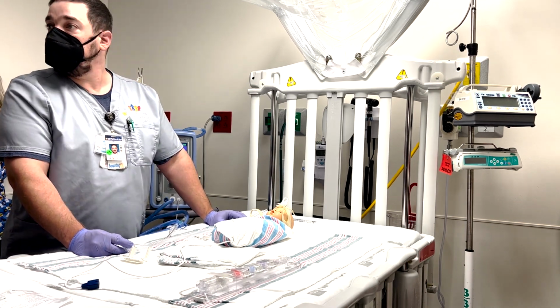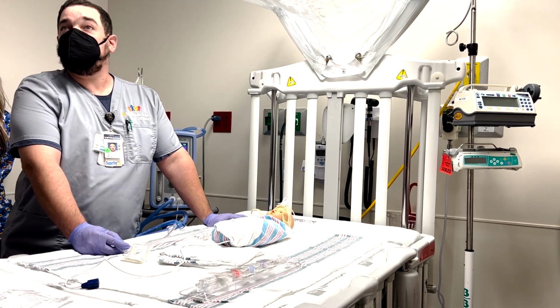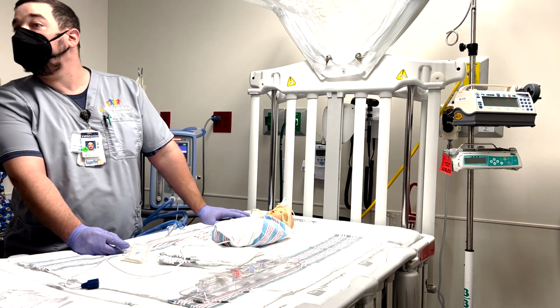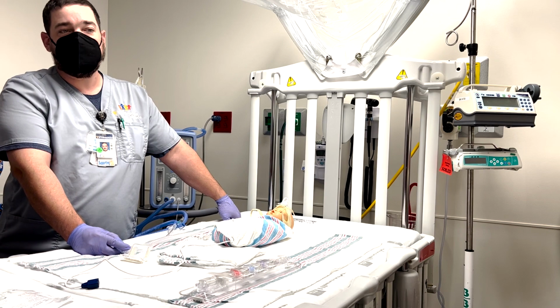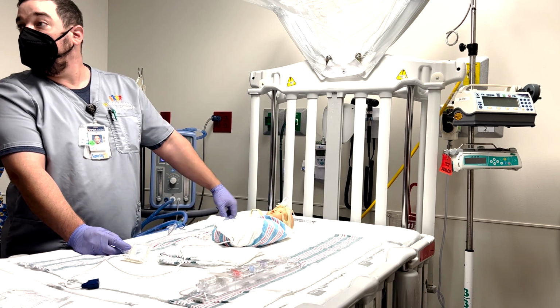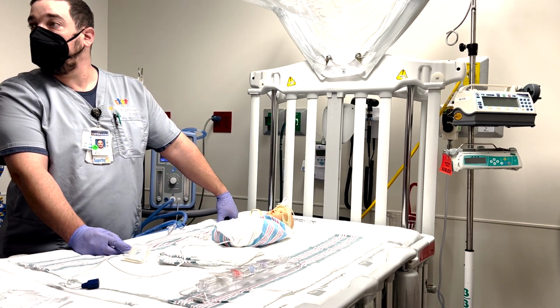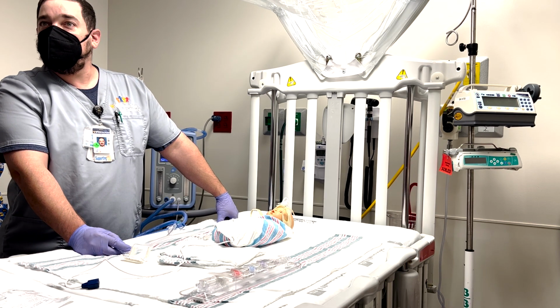What's the age limit for CPAP right now? Because nasal CPAP's not going to work on a school age kid. No, it's not. Again, it's more of a measurement limit. Say I could get a 10-month-old that has a tiny head, a head circumference under 42 centimeters, then yes. And we're just not doing face mask CPAP for asthmatics or anything like that. Generally speaking, though, that's a good question.